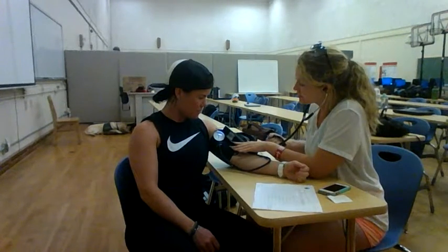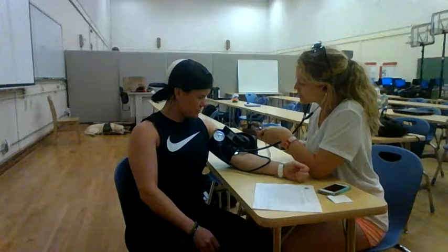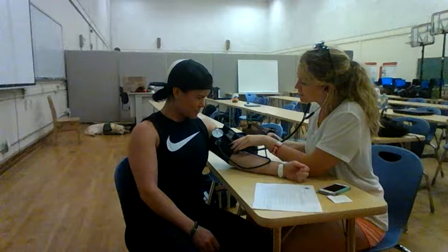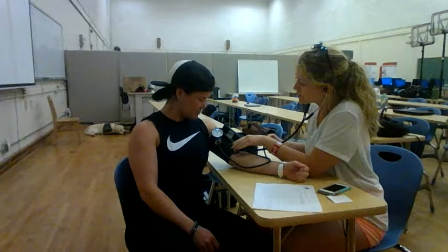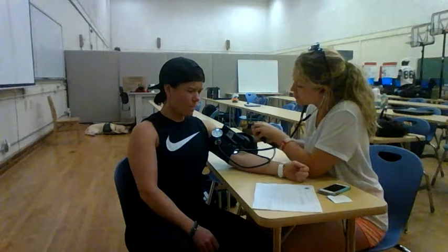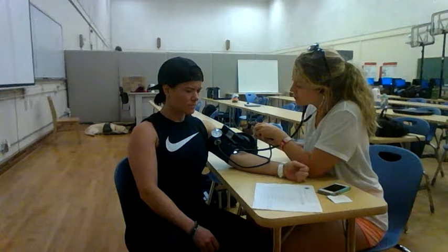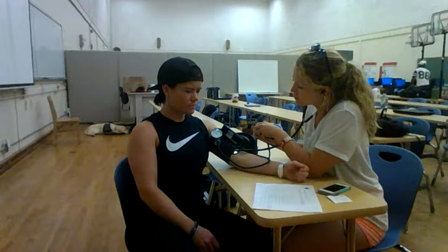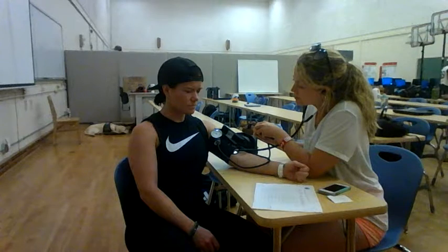At this point, the subject has been at rest for nearly 5 minutes. We will now measure heart rate and blood pressure. These measurements help us set a baseline that we can compare to the data taken during exercise. Once we start exercise, we will take measurements of the subject's heart rate every minute to determine steady state. Steady state is a point at which 2 consecutive measurements are within 5 beats per minute of each other.